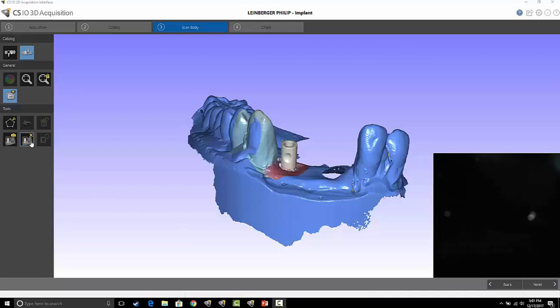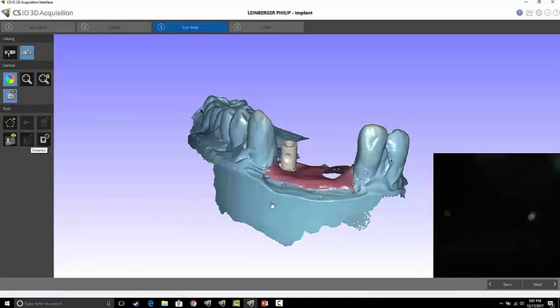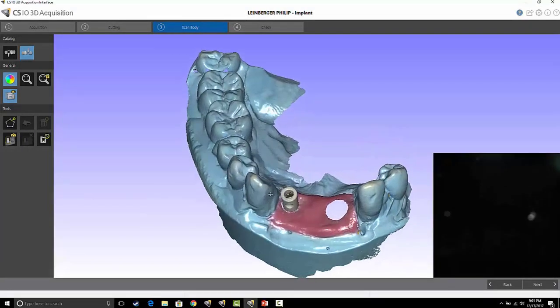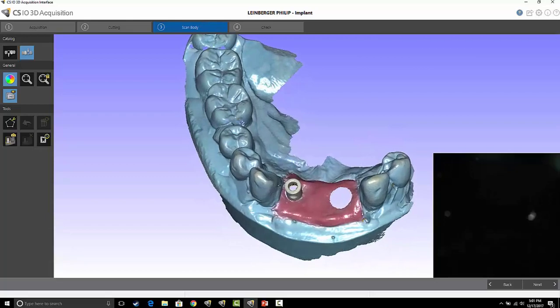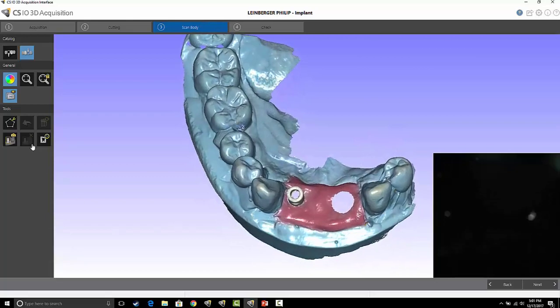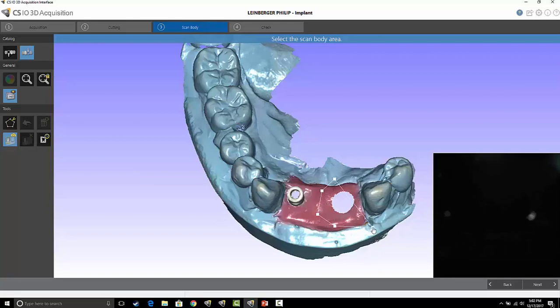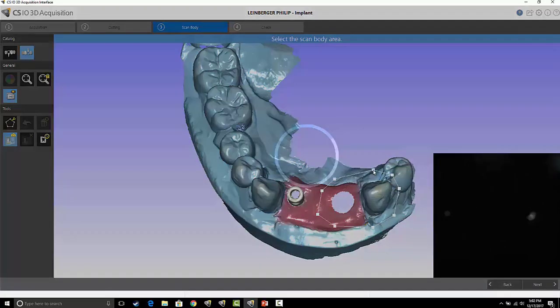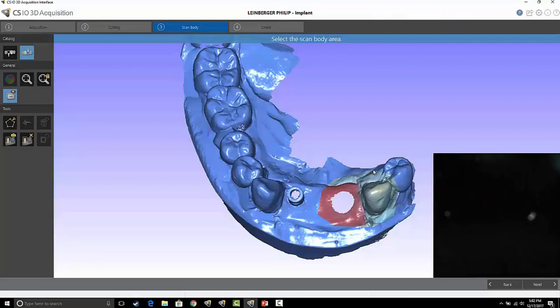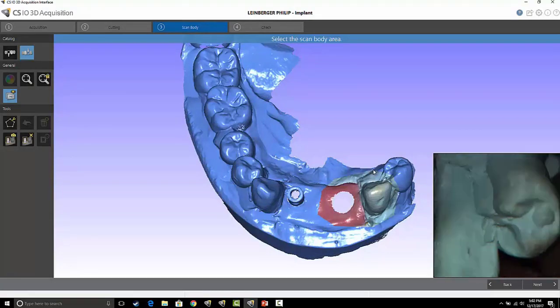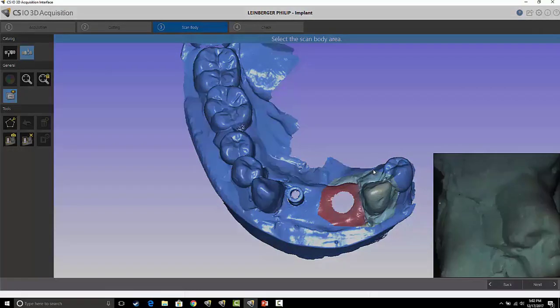Then I simply delete that existing area and I'm going to highlight the next area, again using the adjacent tooth to re-register the scanner.